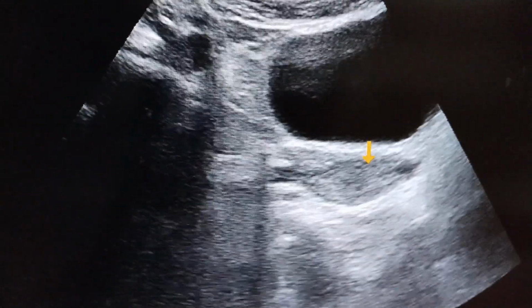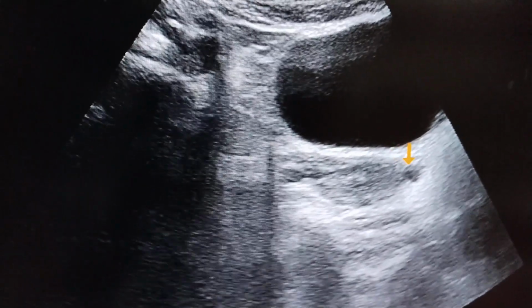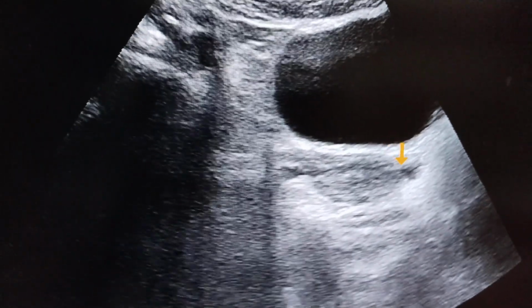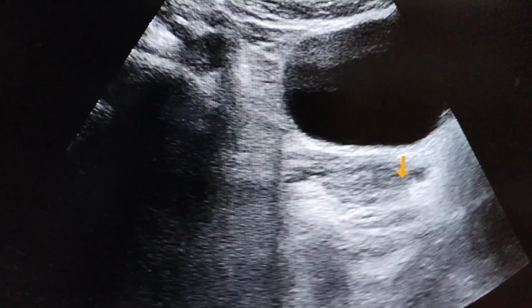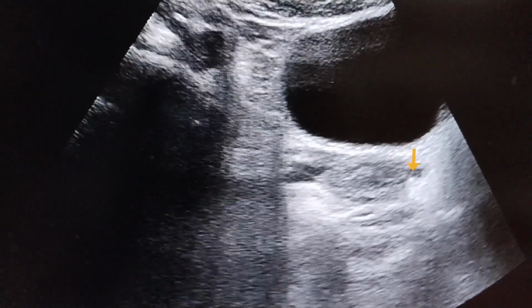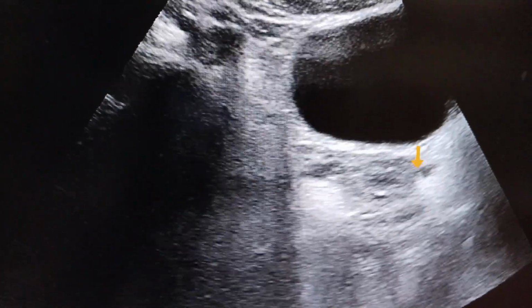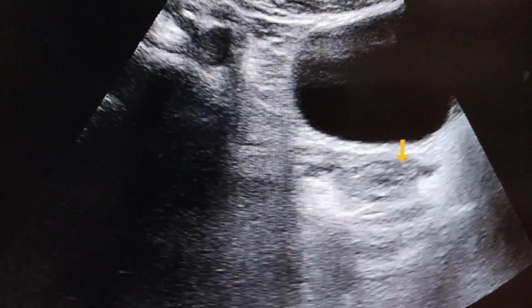And if we closely observe, due to the descent of the uterus, prolapse of the uterus, the body of the uterus is compressing it. This one. This is the uterus. So here it is compressing it.